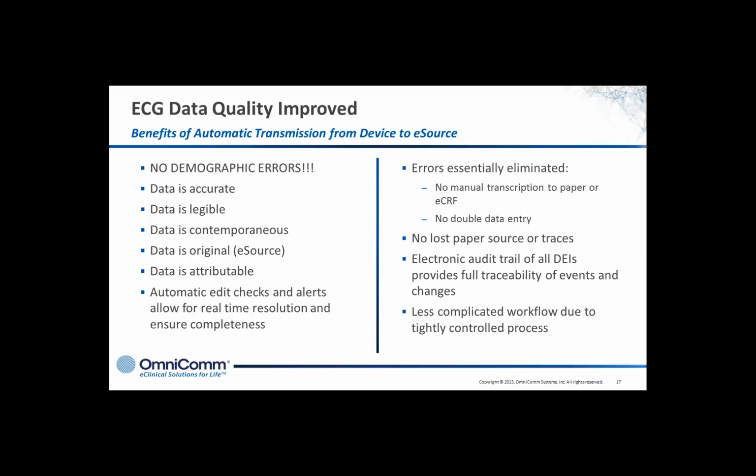It eliminates a lot of steps that were happening previously in sites, but the Surveyor model is really the preferred model, again, because you're eliminating any manual error or issues with the scanning of the barcodes. And so the Surveyor process eliminates that by sending those orders automatically.